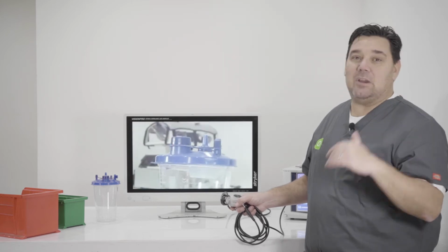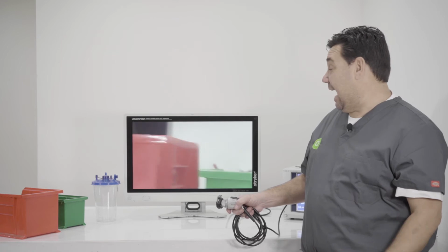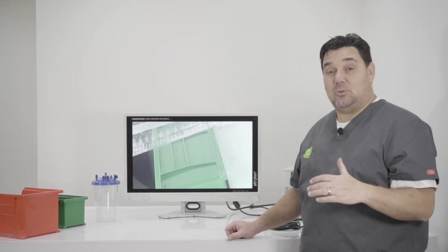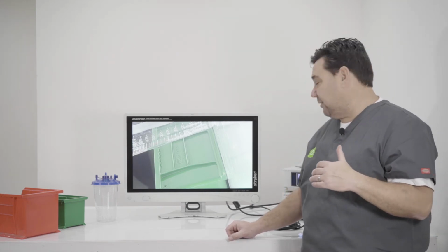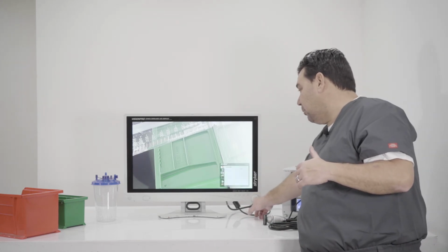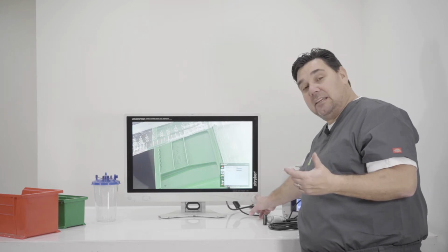But we know that we have some pretty good color settings already, just based on looking at red, green, and blue. To get into the color settings on the actual display, there's a sequence that you have to do. The one thing you want to do is push the button, and then scroll. Right now you're in the brightness setting.